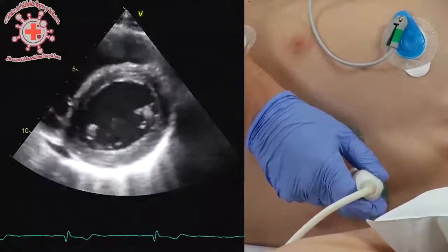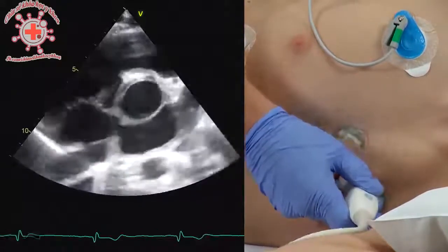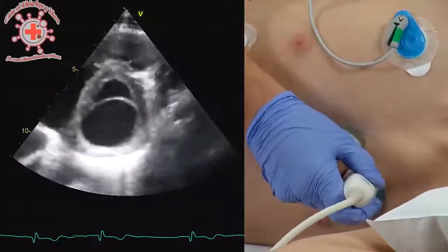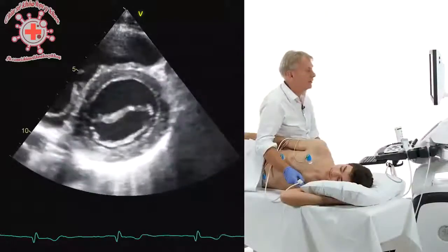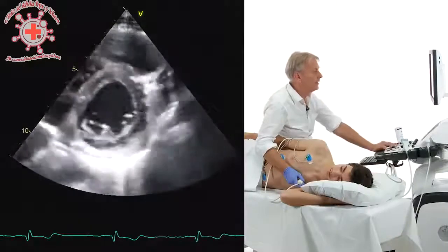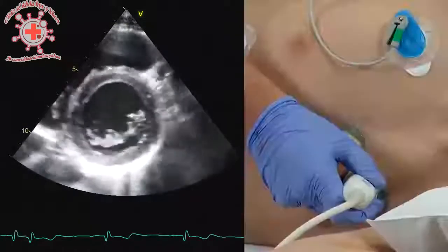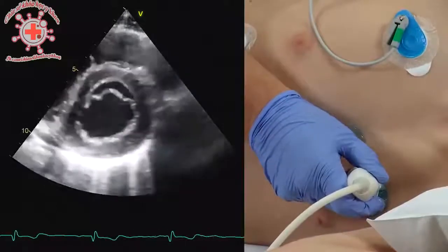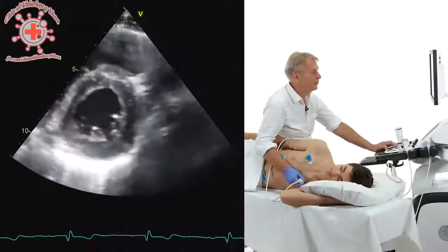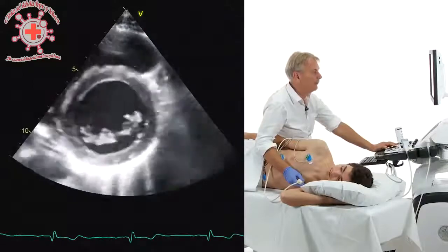Try to have the ventricle in the center of the image. You can correct that by moving the transducer either towards the left or towards the right. The other important tip that I would like to give you is try to see that you see the anterior leaflet not discontinued, because if you do, then you are a little too far towards the apex. That's where you actually have the chordal structure inserting into the anterior leaflet. So this would be the optimal view.